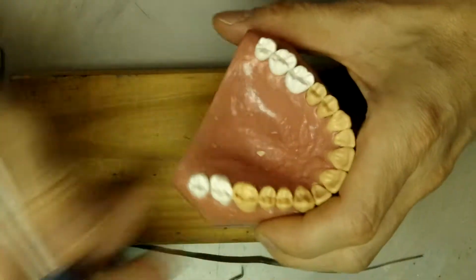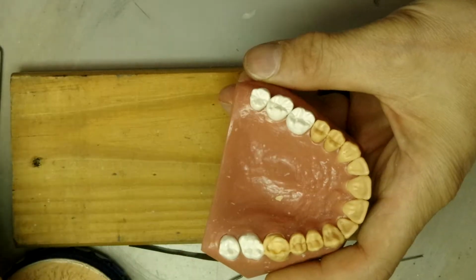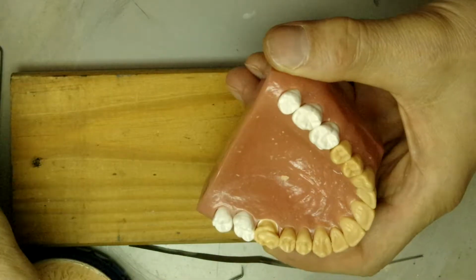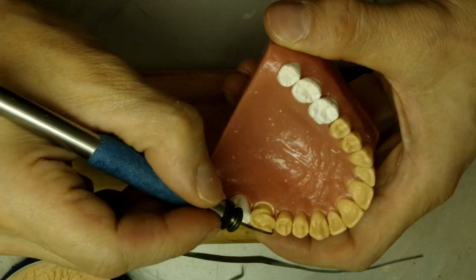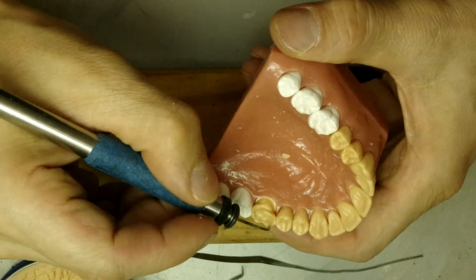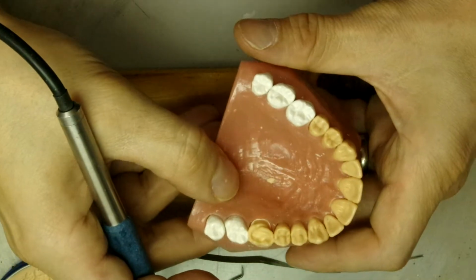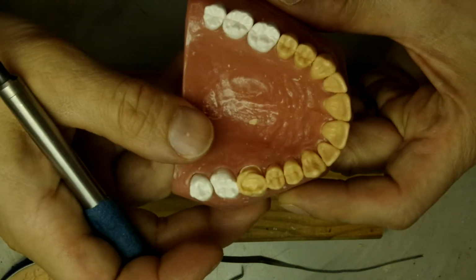Okay, so now let's puddle in that little area here. This will give us a little more stable space. Alright, let's get these cusp tips in line, to make that into a rhomboidal shape.